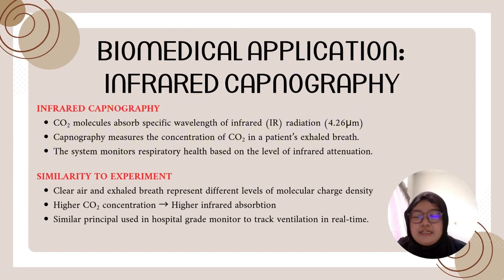Hi, I'm Nur Fatin Farzana and I will be explaining about the biomedical application for our capnography. For capnography, the carbon dioxide molecule will absorb the specific wavelength of infrared radiation, which is 4.26 micrometers. The capnography will measure the concentration of carbon dioxide in a patient's exhaled breath. So the system will monitor the respiratory health based on the level of infrared attenuation.